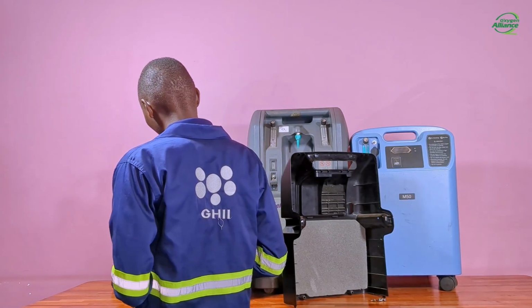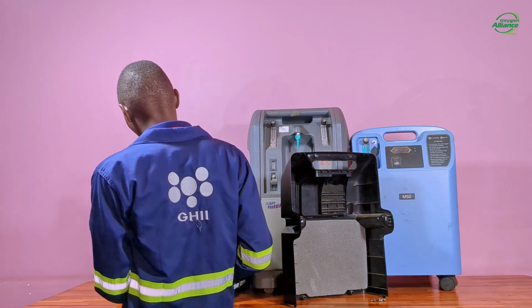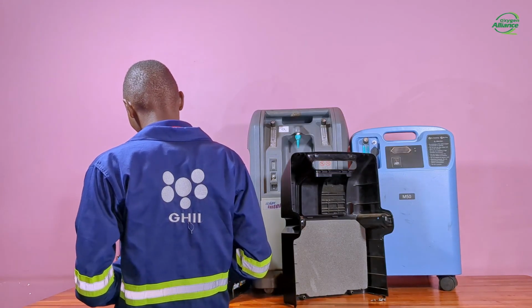After opening the unit, now we can have access to the rotary valve that we are talking about. To inspect the valve, I will also turn on the unit to see how it is rotating.